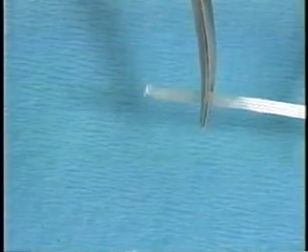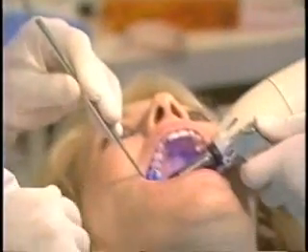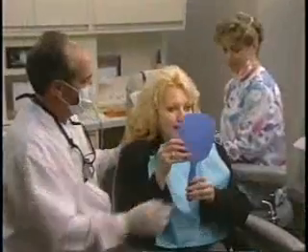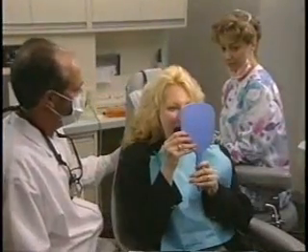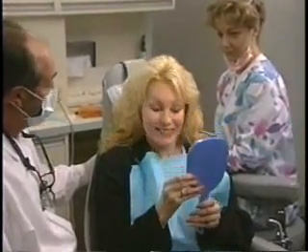The glass band system is quite different from all other fiber reinforcement systems. It's easy to use, it's thin, it easily adapts within the mouth. It requires no special gloves, no special scissors. The material itself is user friendly, it's doctor friendly, it can be easily applied. The patients will find tremendous satisfaction out of the restorations you'll create for them. You're going to find that without any special training other than this videotape you'll be able to start immediately using the glass band system in your practice.